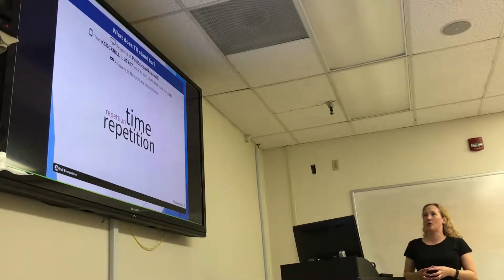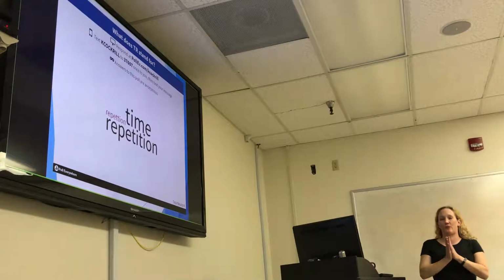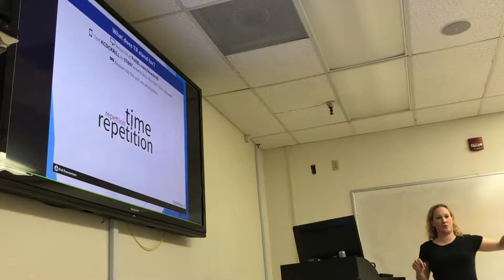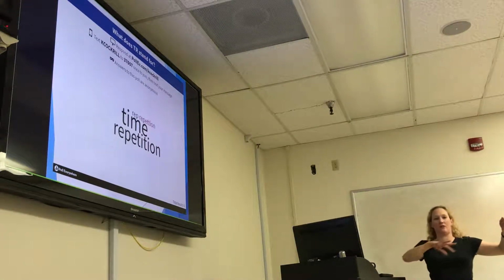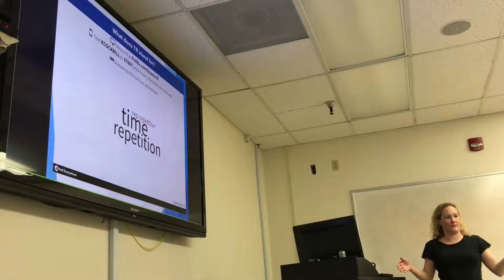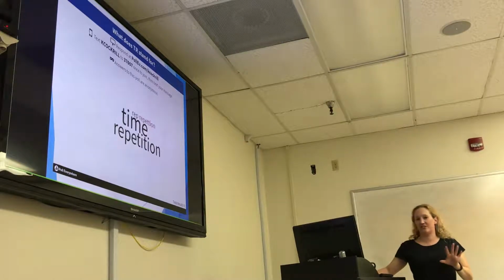Yep, good job. So yes, our TR stands for repetition time. And again, that's the time between slice 1 excitation, and we do all of our other slices, and we come back to slice 1, and that's our TR. All right? Questions on that?